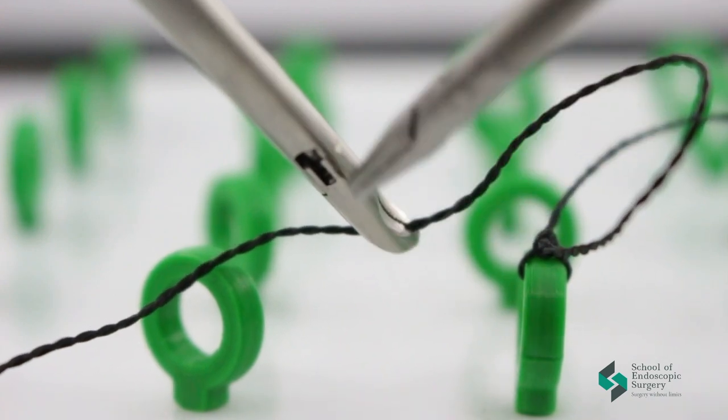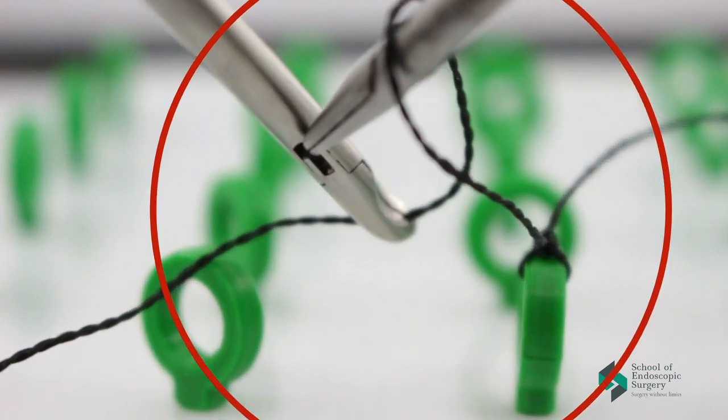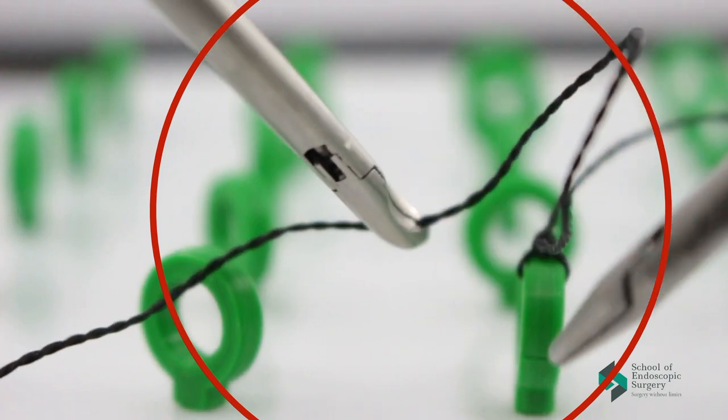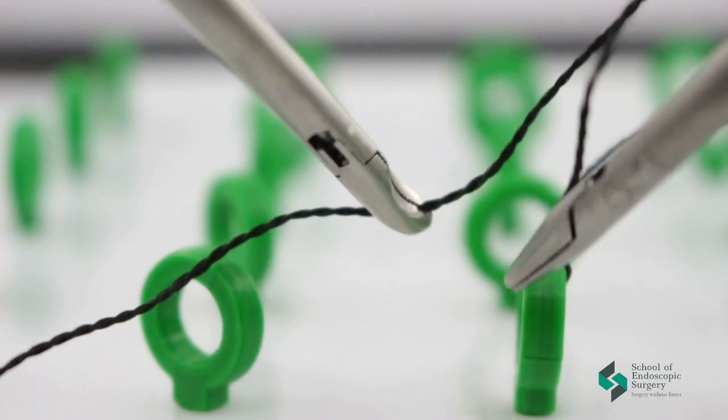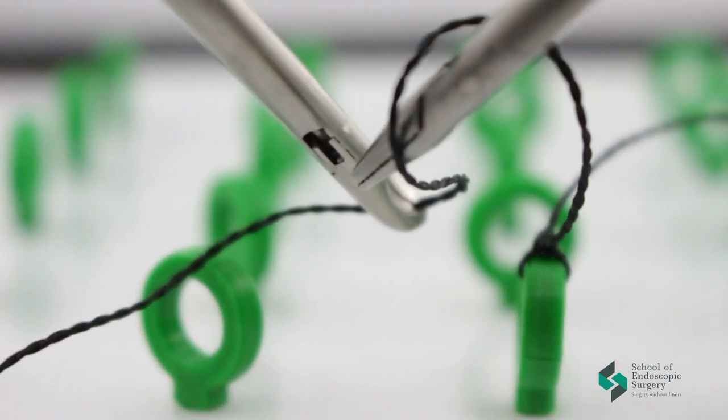The next mistake is large instrument rotations. Endoscopic surgery likes small and precise movements. Try to work only around the thread.